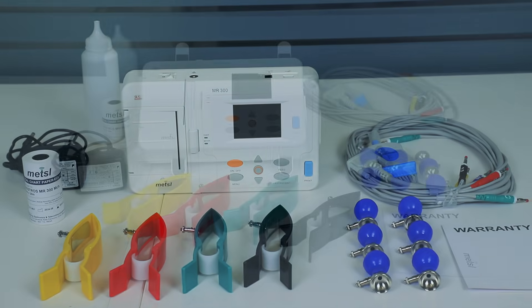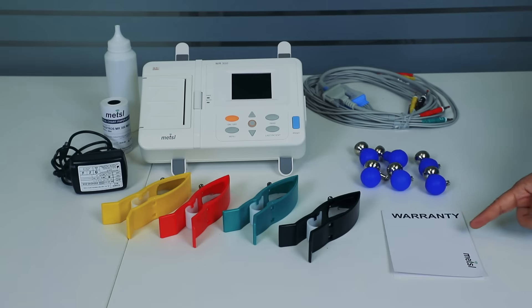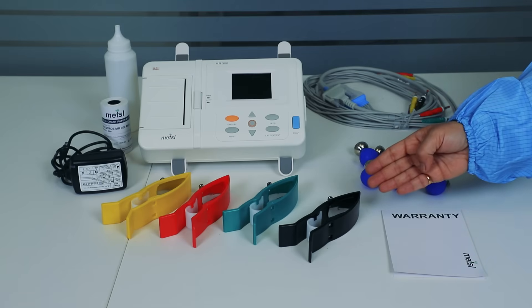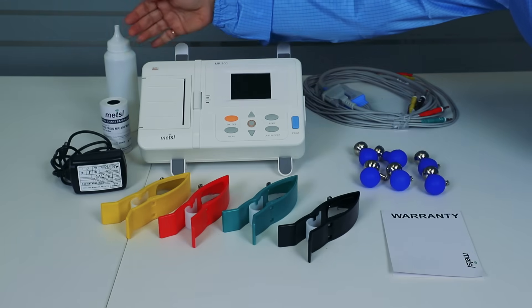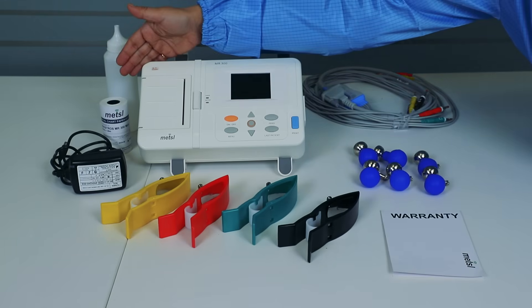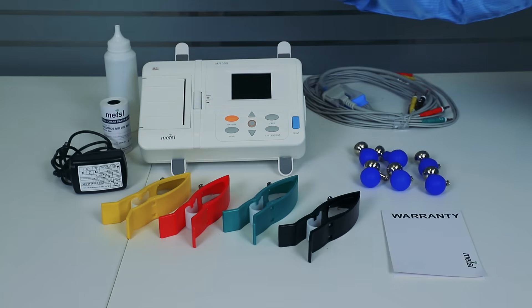This includes the 10-lead ECG cable for comprehensive readings, reliable balloon electrodes for chest leads, your warranty card for peace of mind, durable clamp electrodes for limb leads, a bottle of ECG gel for optimal signal quality, a fresh thermal paper roll for instant printouts, and a power adapter for charging and continuous operation.